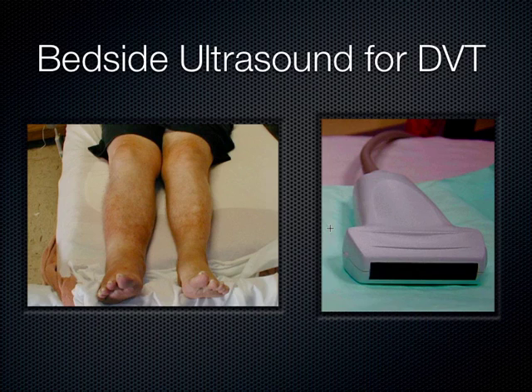All right, guys. Talk about ultrasound for DVT.